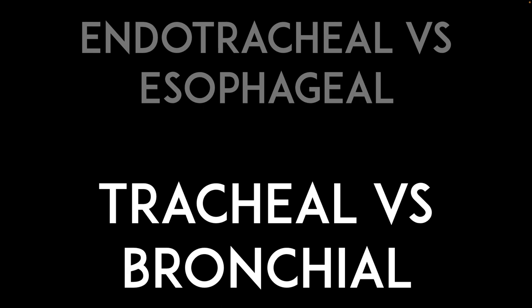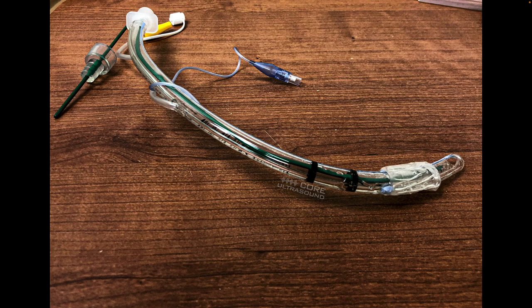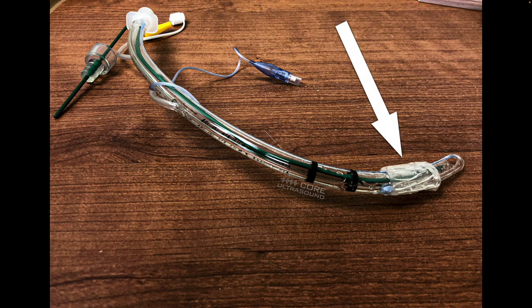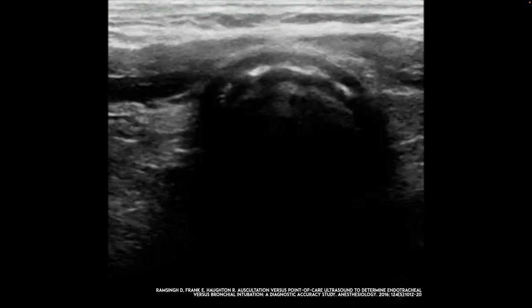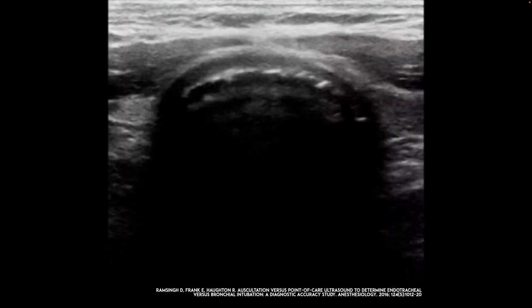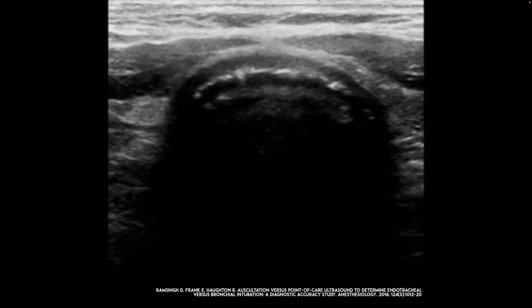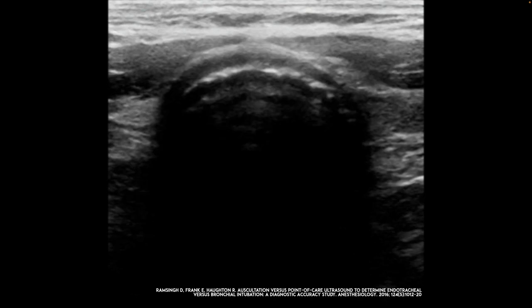There are a couple of different methods you can utilize, and really where it comes down to is being able to identify where that balloon is on the end of the ET tube. Now, one thing you can do is place the transducer in the suprasternal notch and identify what you think is the balloon or the area where the balloon should lie. The balloon itself should actually lie right at the suprasternal notch - just underneath the cord. If you place it there and inflate the balloon under real-time guidance, you'll see almost like a flexing and relaxing of the lateral width of that trachea, which tells you that is the balloon because that's what inflates when you inflate it.